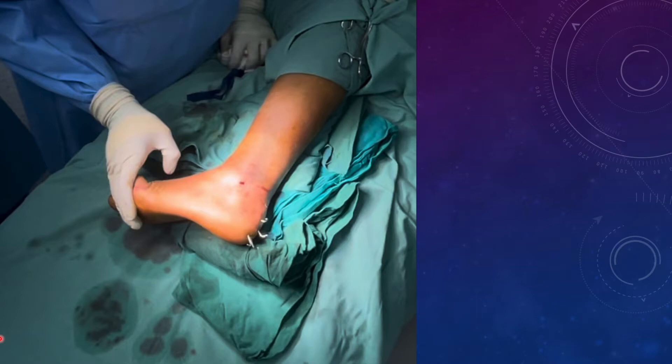Conventionally, we use the lateral position for operating on calcaneum fractures, and this is the kind of position we get after putting the limb on the operating table. So if we see the ankle from above, this will be the radiograph we'll be getting — this kind of picture.